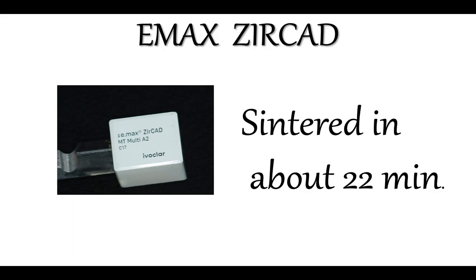So you should have a milling machine just specific for zirconia because the milling machine is dry, and the wet machine is for glass ceramic. So if you mix them, you have to change the burs in the milling machine, and it takes time. And it may create chaos because it's not a good practice to have only one milling machine to do both, because it's not good in time to remove the burs and put on the burs and remove the burs, because they use different burs.